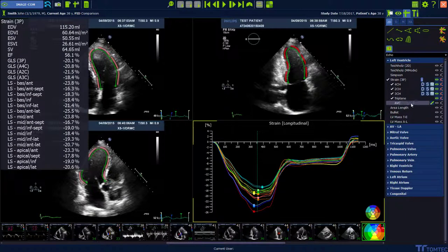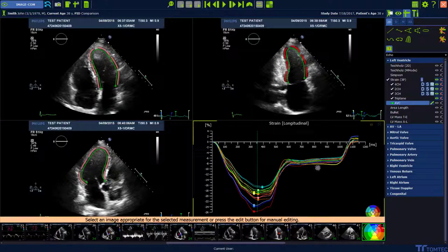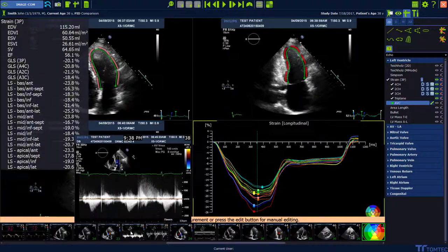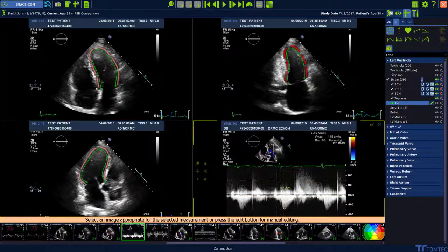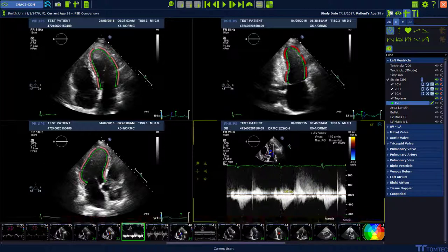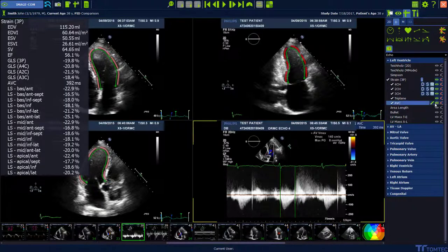To measure the aortic valve closure time, select the AVC option. The AVC can be measured in a Doppler image of the aortic valve, or it can also be added manually by clicking the select button.